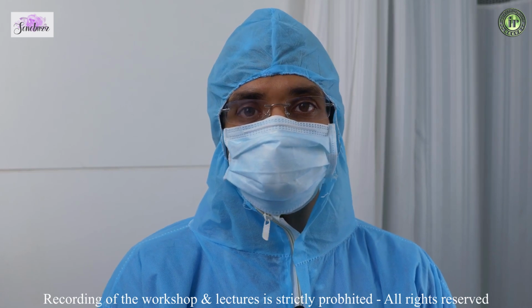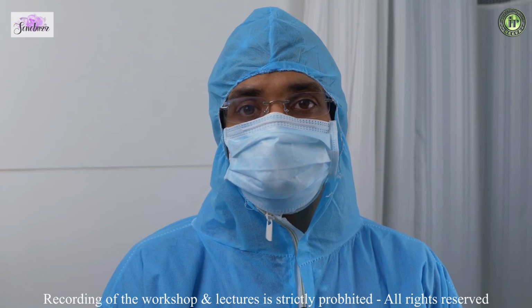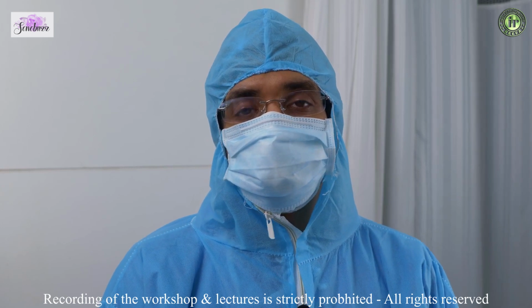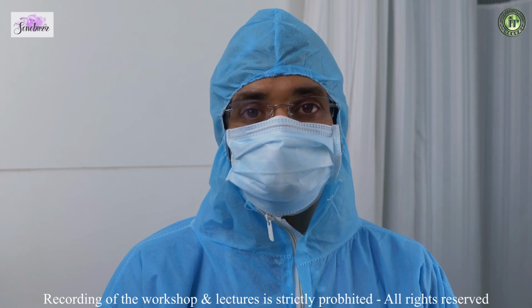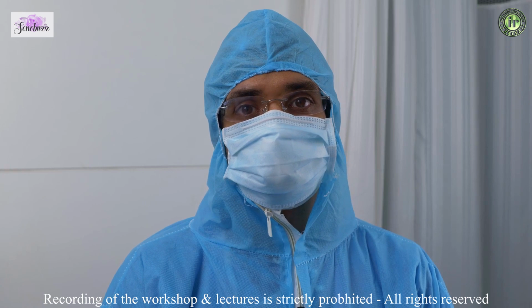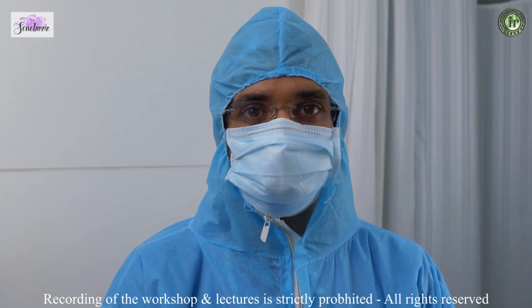You need to understand what type of disease you're looking at, whether it's hepatitis B, hepatitis C, or an alcoholic fatty liver disease. You need to look at all the LFTs, any previous scans, if the patient is on medications, and all this has to be kept in mind before you go on to your elastography reading.